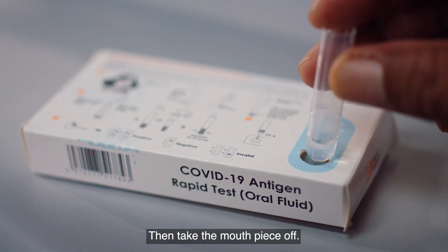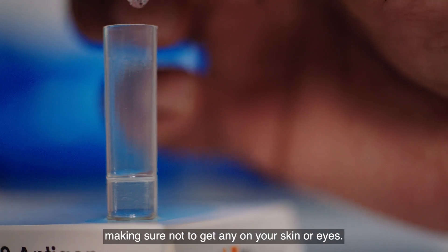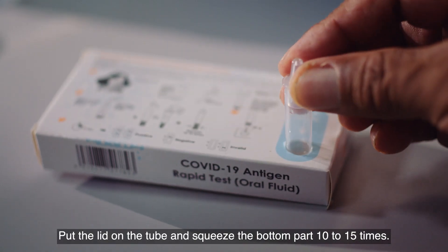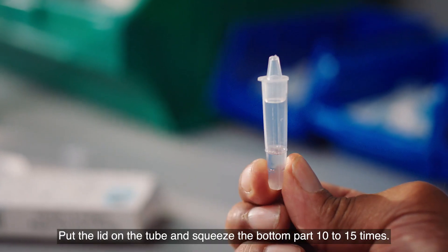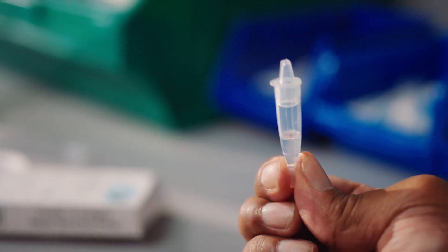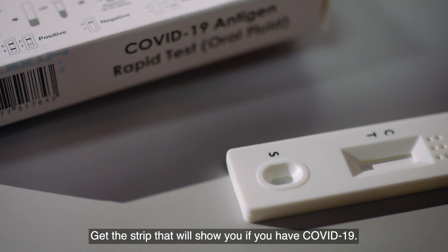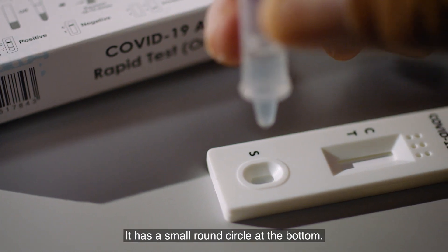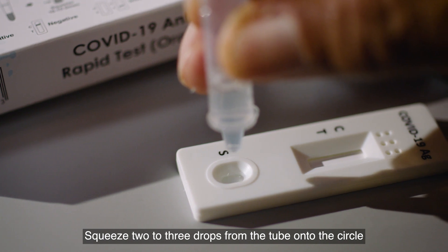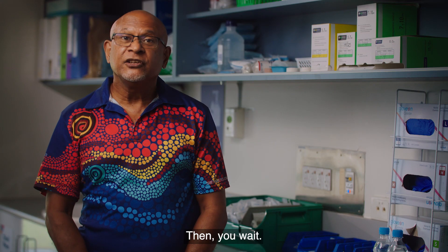Then take the mouthpiece off. Open the pack with the buffer and pour it into the tube, making sure not to get any on your skin or eyes. Put the lid on the tube and squeeze the bottom part 10 to 15 times. Get the strip that will show if you have COVID-19 — it has a small round circle at the bottom. Squeeze two to three drops from the tube into the circle and set your timer for 15 minutes. Then you wait.